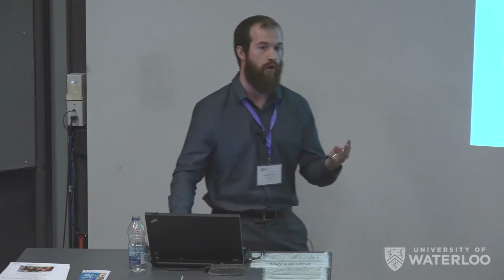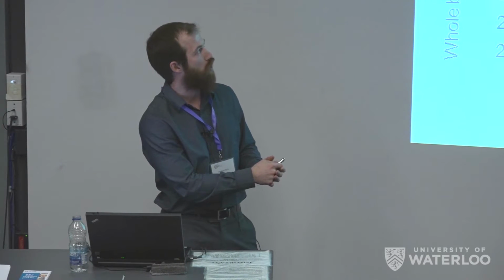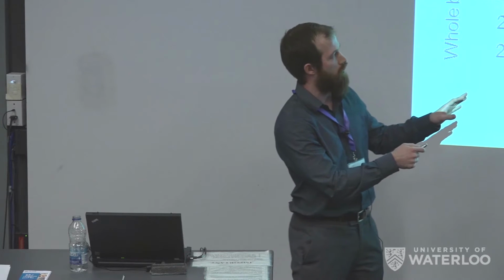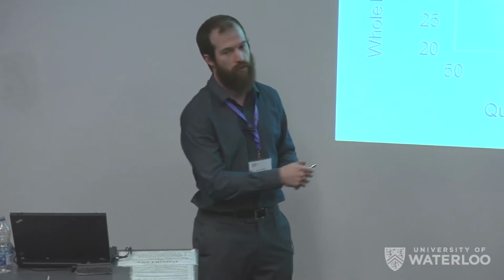And when we look at the correlation we've obtained, basically we have our DEXA lean tissue on our y-axis and our quad thickness on the x-axis here. And we obtained a fairly strong correlation, an R squared of 0.75. But if we look here, the open circles are the females and the closed circles are the males, we do still see quite an amount of variability around this line, especially with the males.